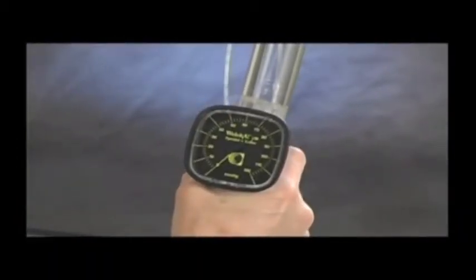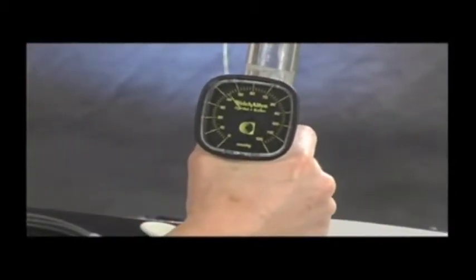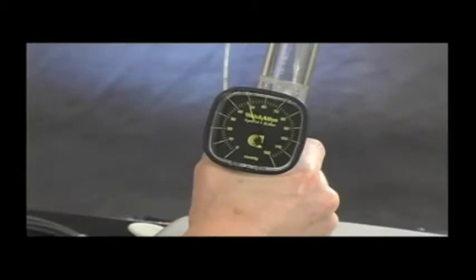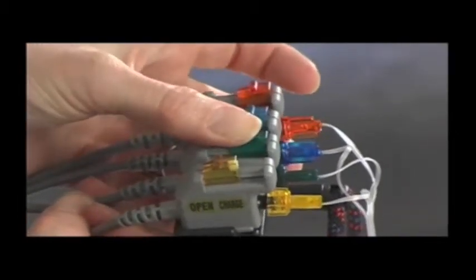Once an airtight seal has been achieved in the calibration chamber, squeeze the black bulb gradually until chamber pressure is 50 millimeters of mercury, as indicated on the pressure gauge. The pressure can be adjusted by lightly pulling back on the red valve lever. When the reading of 50 millimeters of mercury is steady, grasp the cable block end and click each of the 4 switches into the charge position. You will note that the balloons will be slightly inflated after this step. Also, a pressure response on the equipment screen software can be noted. Lastly, bleed the pressure from the chamber to 0 by pressing the red valve lever into the down position.